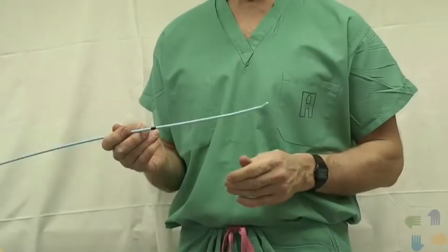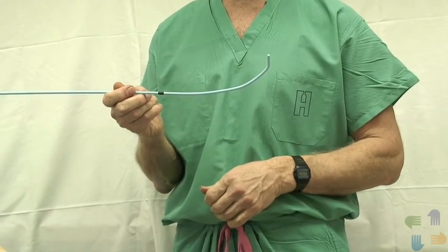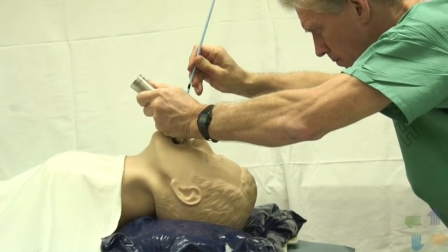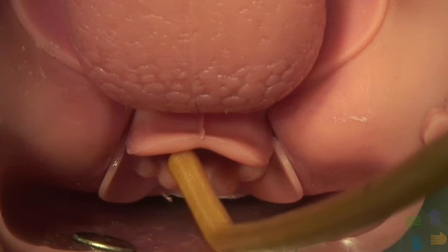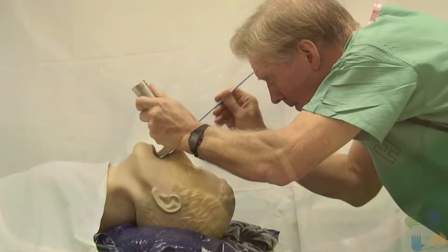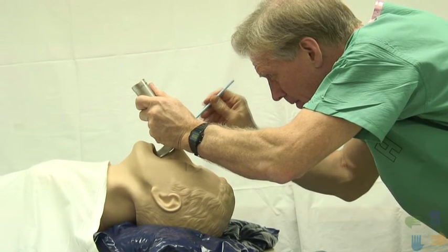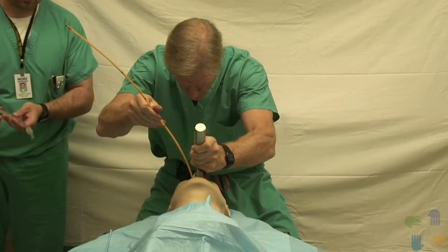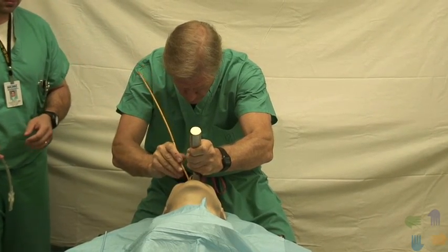If you anticipate a difficult airway, create a 60-degree bend in the distal portion of the bougie. Then, if you're unable to visualize the laryngeal inlet, carefully insert the curved bougie along the curve of the tongue, slipping it anteriorly just under the epiglottis. Confirmation of correct placement must then be non-visual, either by feeling tracheal rings or encountering resistance from the carina at 40 centimeters. The bougie is a simple, inexpensive airway adjunct that can be very helpful when visualization of the laryngeal inlet is difficult.